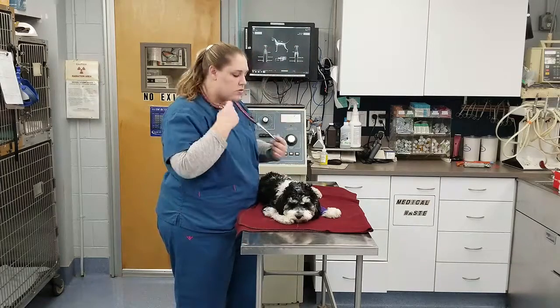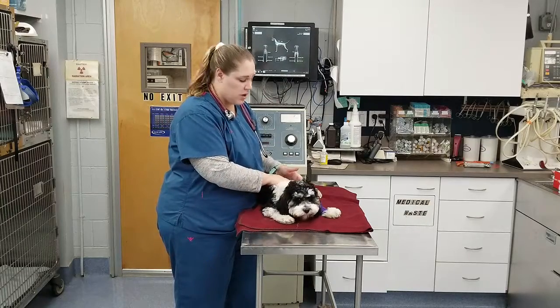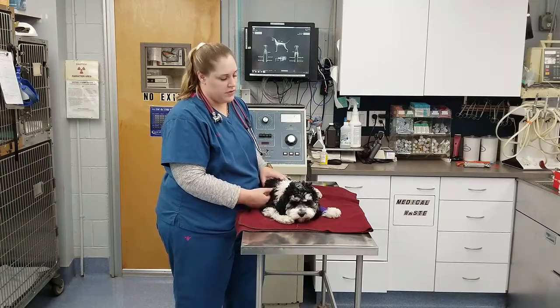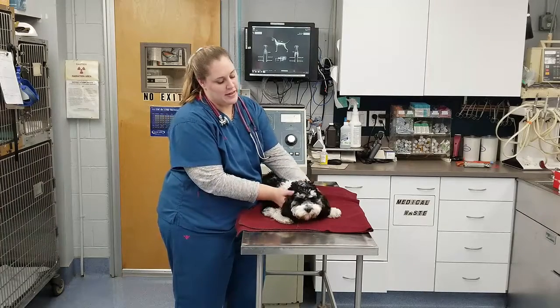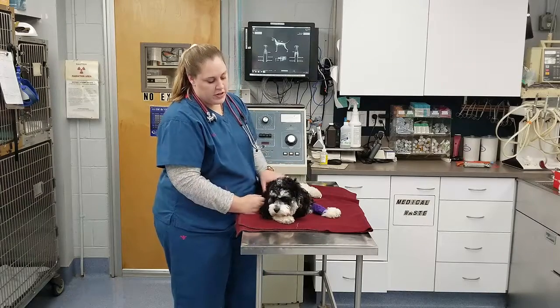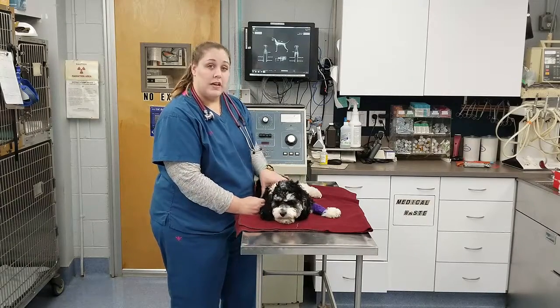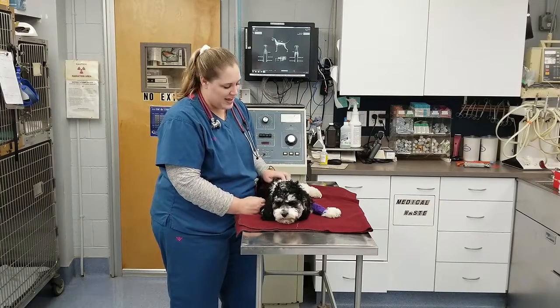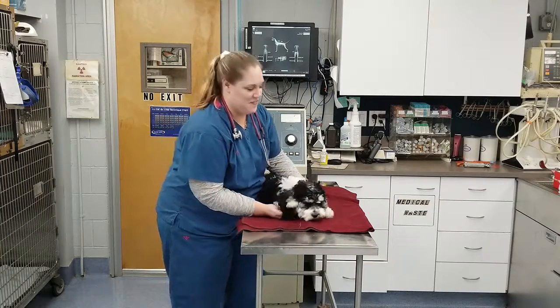Okay, so no murmur, no crackles, no wheezes are heard. He started whining a little bit while I was doing that, so I did hear a little bit of referred noise back, but other than that, I didn't hear any abnormalities in my auscultation. So everything still checks out in his post-surgical checks here. I'm going to note that in his chart, and we're all set. Thank you.